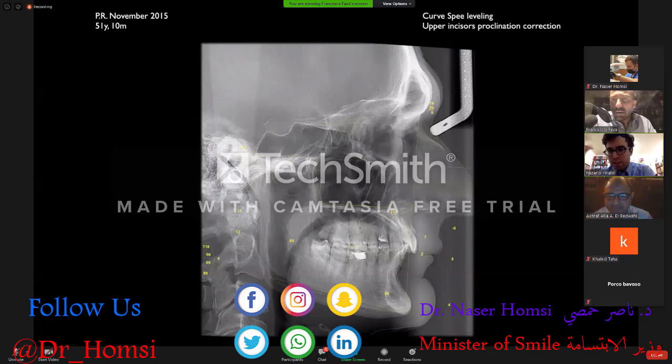It means the acceptance, l'accettazione del paziente di avere tutti questi fili metallici. It can be a problem if the patient requires no braces at all. Segmentary technique has a big advantage with respect to other possibilities, and it's very fast, gives very quick results, and it gives us some advantages.